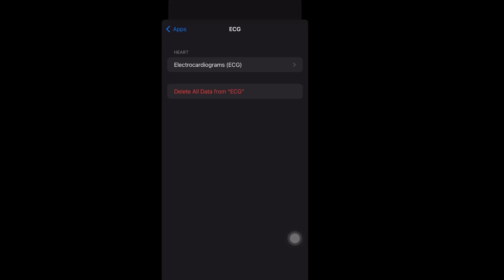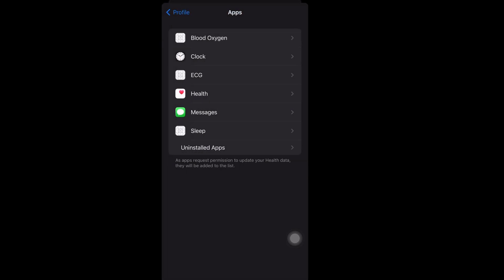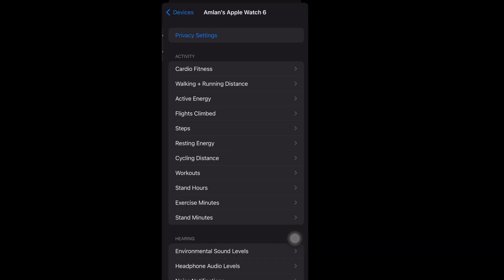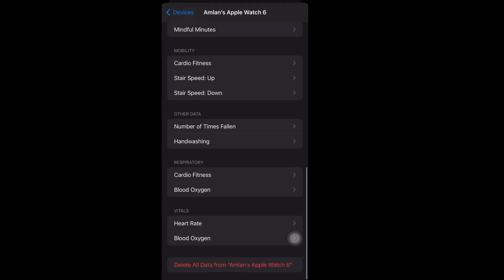You have to delete all data from here. After deleting, go inside Devices. Inside Devices you can see your Apple Watch Series 6. Scroll down and after scrolling down you will get the delete option, so you have to delete all data from here as well.